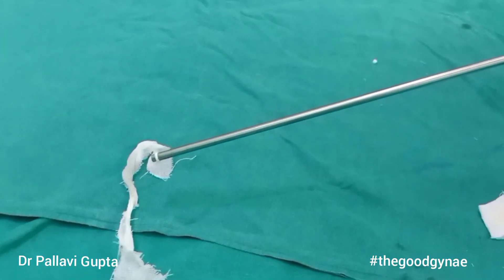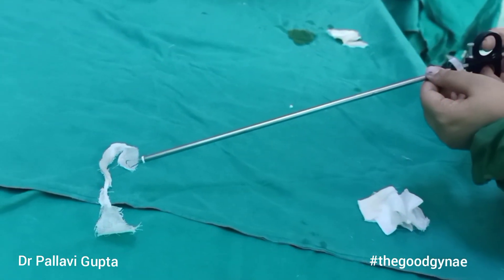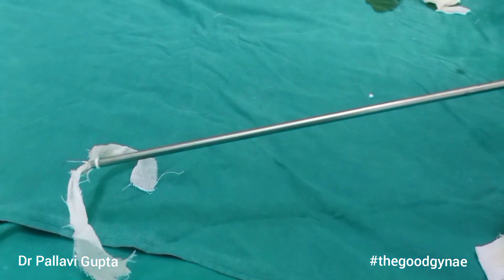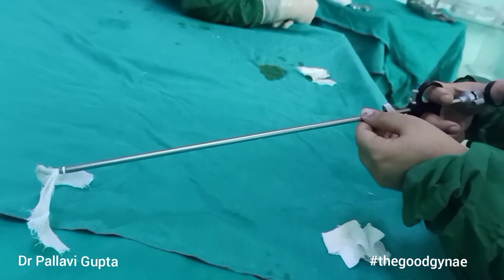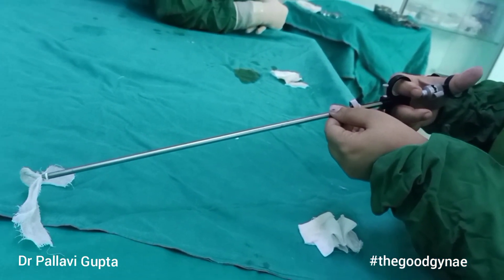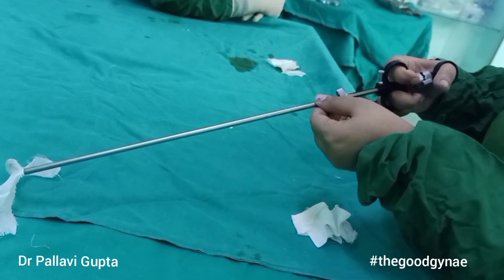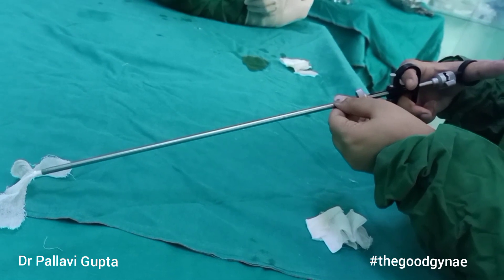Here we have loaded one ring and selected number two. We now enter the peritoneal cavity, visualize the fallopian tubes, and go near them. At the handle, we move the fingers away from the thumb, which opens the jaws. We get hold of the fallopian tube and move the fingers towards the thumb, which closes the jaws and pulls the fallopian tube inside the lumen of the laprocator, releasing a ring over the tube.